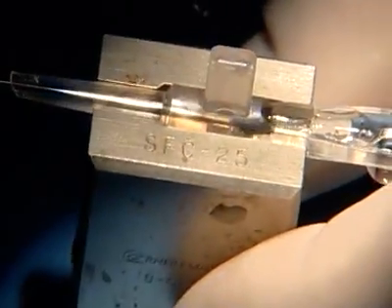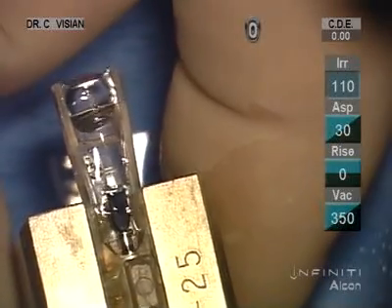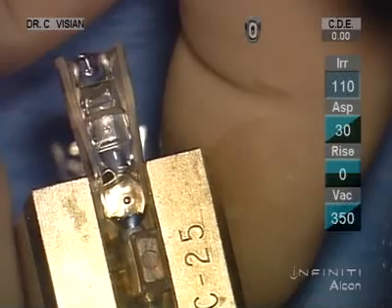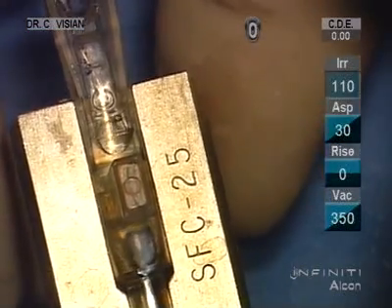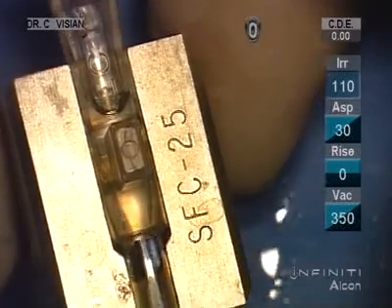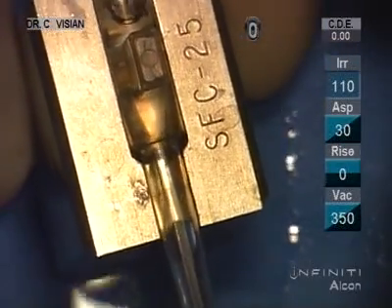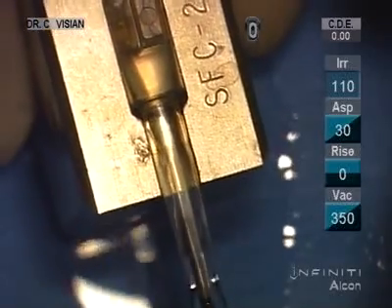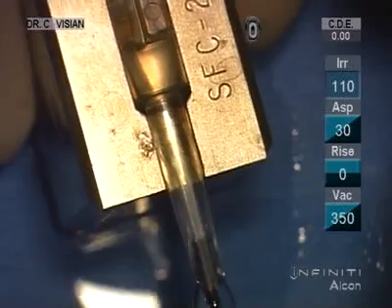We use our other forcep and grasp the haptic leading footplate up to the positioning hole. That's a counter sort of traction between the two hands to pulse that lens forward.